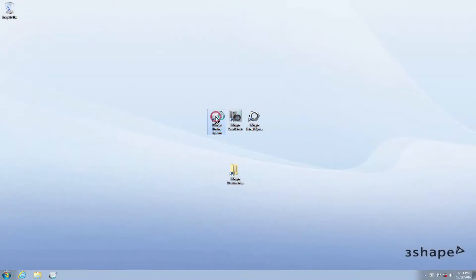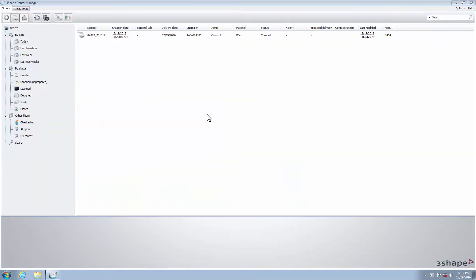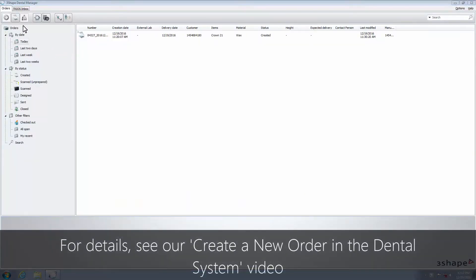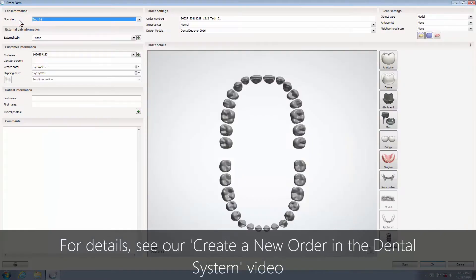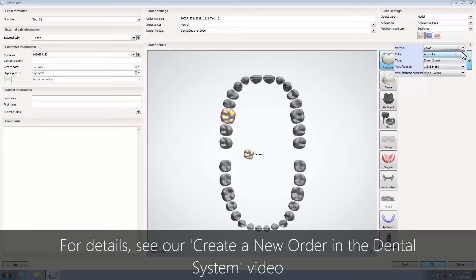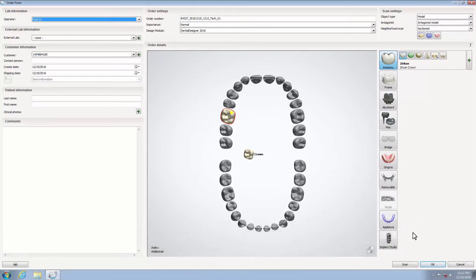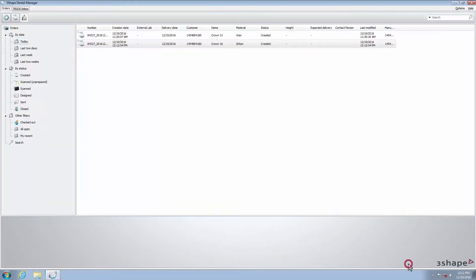Before scanning, please create a new order in Dental Manager. In the Scan settings, select Model, Antagonist Model, and Sectioned. Then create an order for a crown in Order Details. Click the Scan button to continue.